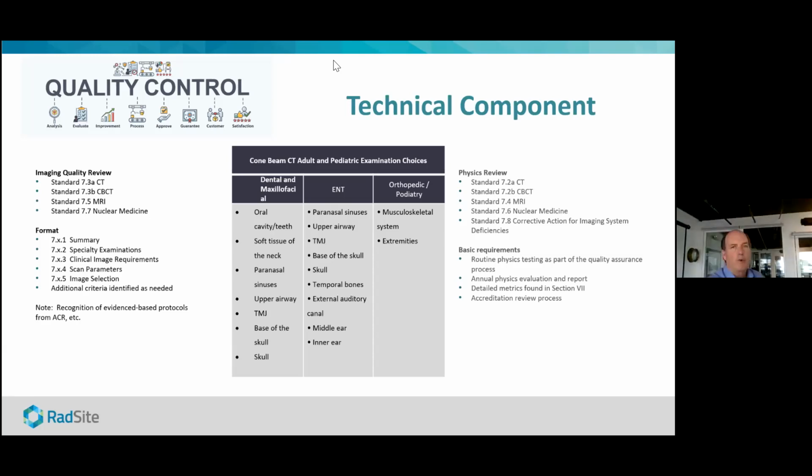Yeah. And it's important to know we have trained radiology reviewers and physicist reviewers, and if there's a deficiency, we're going to communicate that back to the applicant and let them resubmit until they get it right. So this is part of the kind of two-way communication. If there's, for example, a deficiency in terms of the read and the report, there's going to be very specific information why that's deficient, and then there's going to be another chance for the applicant to resubmit that. And really the object of the game for us is to essentially help out in any way we can to elevate the quality and safety of the studies and to provide that feedback.